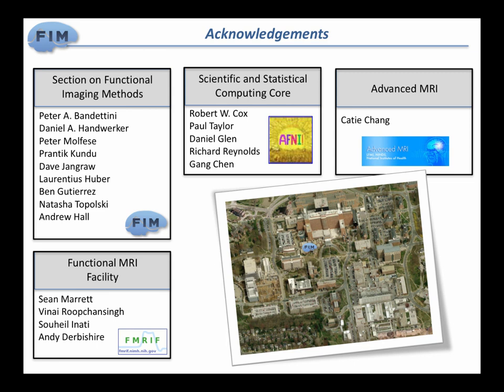So what exactly happens in that convergence of the ICA? I am not an expert on FastICA, I will have to refer you to that. But basically, what the algorithm is attempting to do, this separation of the data into spatially independent components, is just an optimization. It will have a cost function about how well it's doing at that given point. When you get it to converge below a given threshold that you can actually modify in MEICA, but I don't recommend it because you would be stopping the algorithm before it has actually converged, then it says I'm done and it gives you the components.